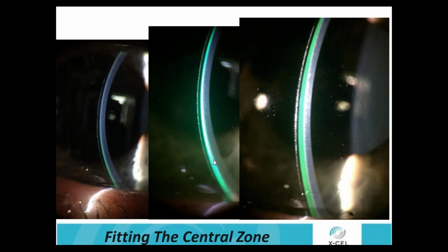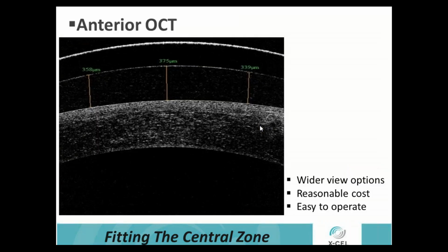We'll talk about our design and how we can control that in our limbal zone. And then you'll see sometimes excessive clearance, where you can see the thickness of the lens and we're seeing at least 2 times that thickness, if not more. And we'll probably have to reduce that as we go through the fitting process.